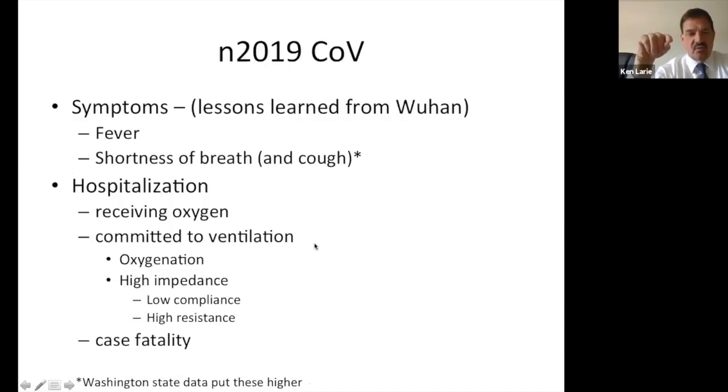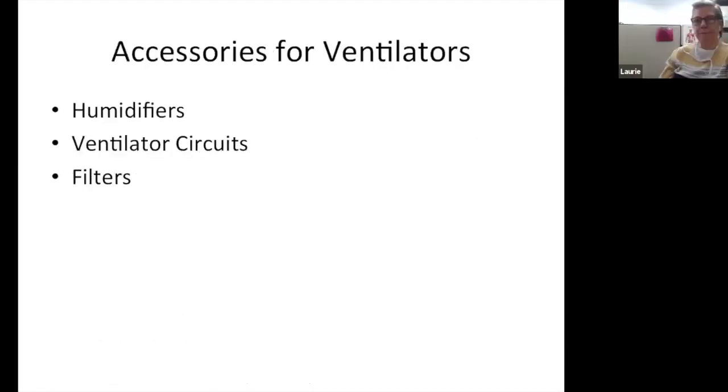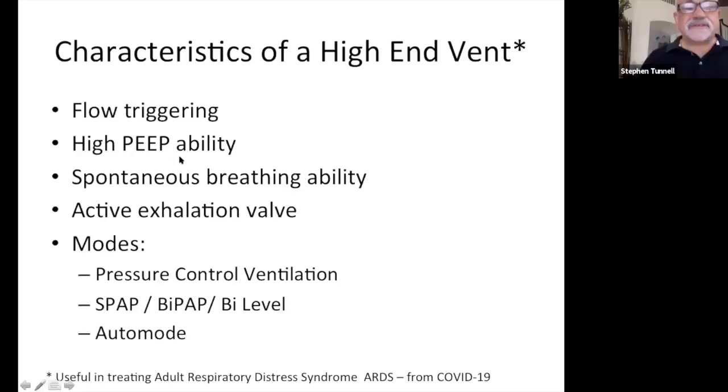Steve, can I go back to point number 2? What is PEEP? I missed that acronym. Yeah, I'm sorry. And by the way, we are in acronym hell, and I'm sure radiology is as well. PEEP is the level of positive expiratory pressure that remains in the circuit. Positive end expiratory pressure is the actual acronym. And what it means is we don't let all the gas out of the ventilator circuit. Why? Because we want to keep that lung inflated.